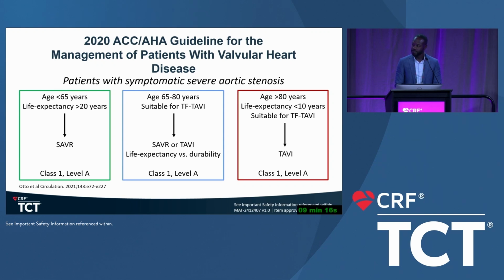What's left is that I just look at it case by case. If I'm not worried about my STJ height or my coronary height, I don't pay that much attention to commissural alignment when I'm choosing the valve. If I have a certain anatomy where I'm worried about what my height is and what my options would be, I'll further consider valve options that can give me commissural alignment. So it's not universal. You don't have to commissurally align in every case.